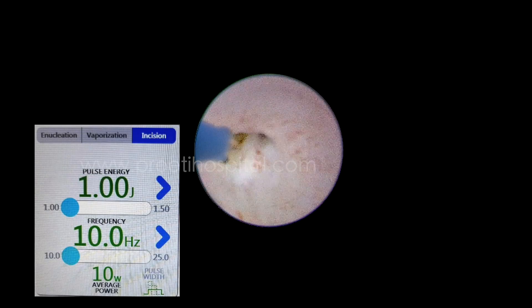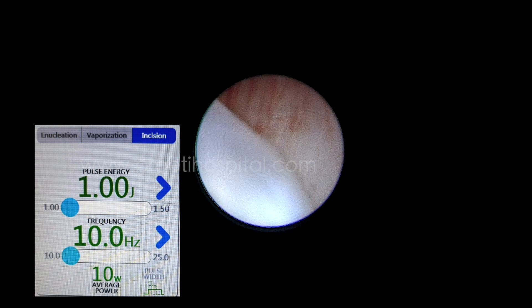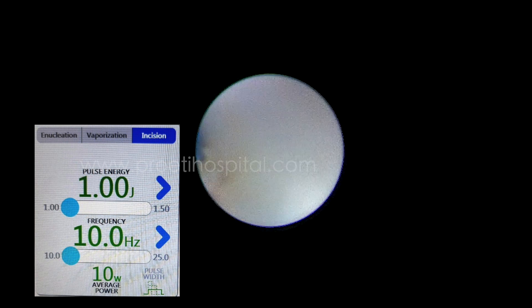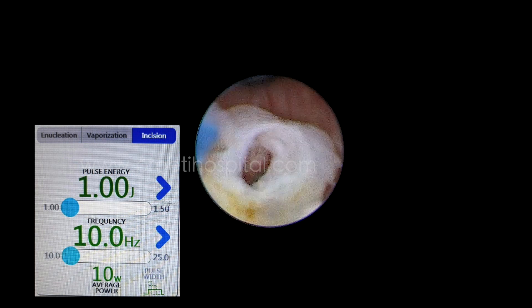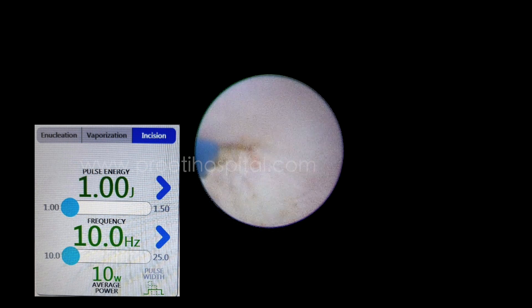You can see the floppy valve and from here I will come anteriorly. This requires a bit of imagination, to be honest, while continuously maintaining the stretch. See, I am coming anteriorly — this is an important part. This is the veru opening of the duct, and now while coming out, every time you have to activate short bursts. See, I am seeing the veru and suddenly it slips off. The laser fiber should be at the tip of the nephroscope.